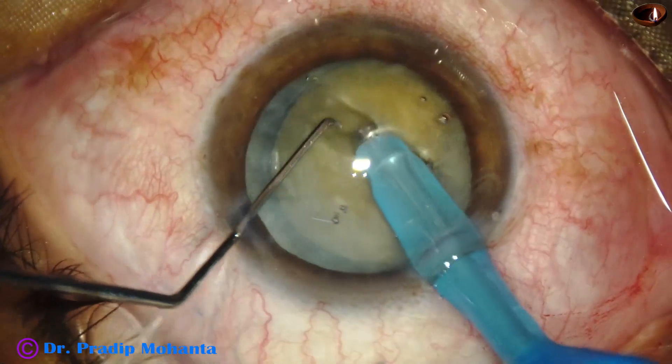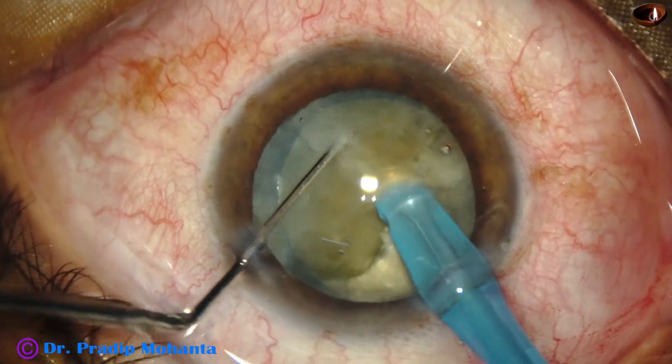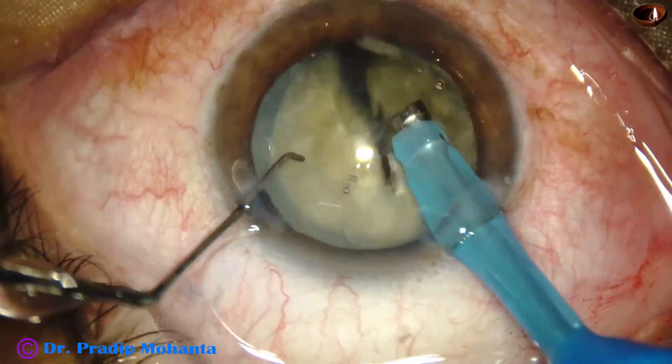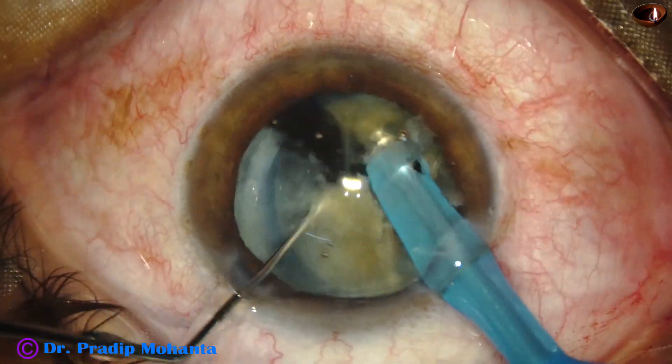Now I rotate the nucleus 180 degrees and separate the two hemi-nuclei completely. Then one hemi-nucleus is divided into two large fragments. Then the other hemi-nucleus is also divided into two fragments.